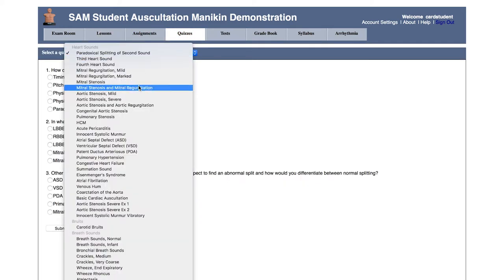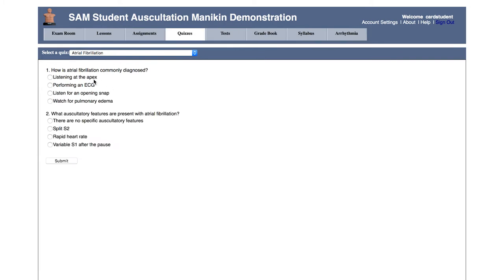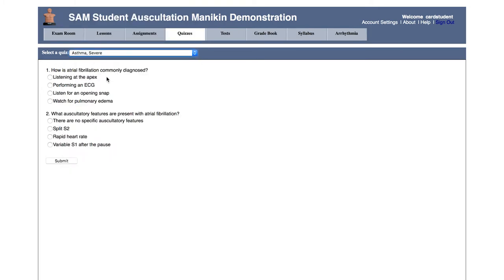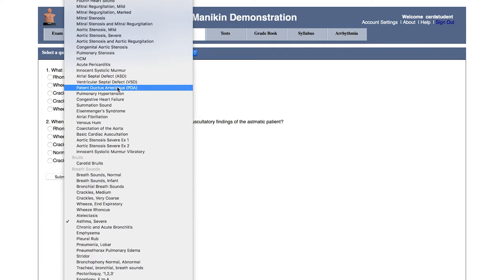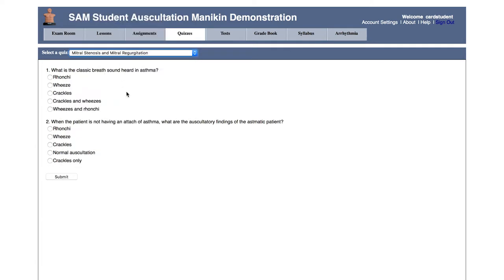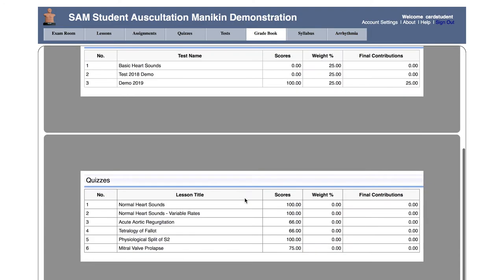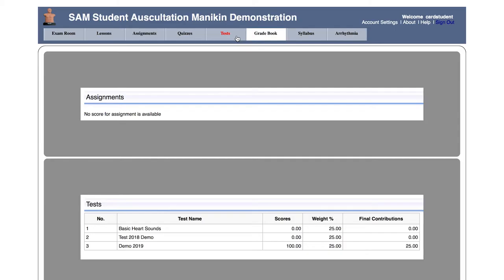Instructors will have access to a host of examination and assessment tools. Custom assignments and tests can be curated according to the relevant curriculum. Students are also able to assess their own progress through our built-in library of quizzes. If you would like to record students' grades through SAM Online, you can do so under the grade book. A syllabus outlining the assignments and timelines can be posted under Syllabus.